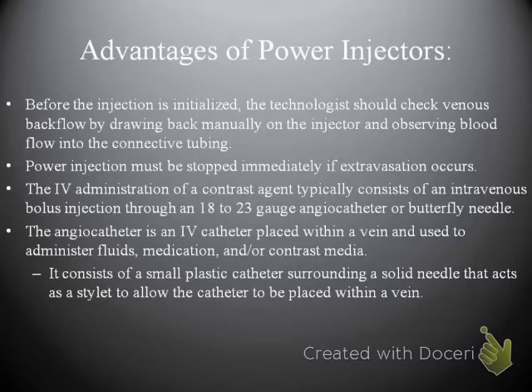The angiocatheter is an IV catheter placed within the vein and used to administer fluids, medication, and/or contrast medium. So we all know what an IV is and all of that. I don't think there's a great discrepancy or concern there. But the real problem lies with the power injector. For all of the benefits that the power injector gives us, it does open up new problems as well, and so it's something that we have to be mindful of, that things can occur.